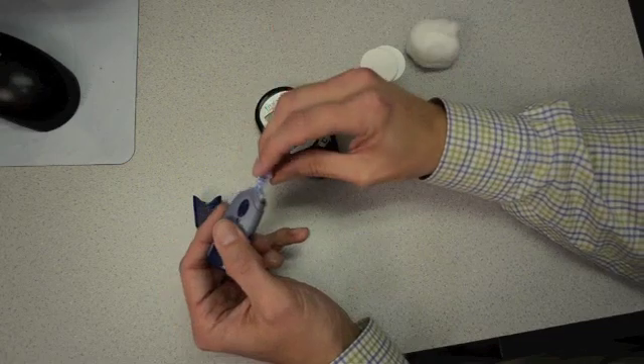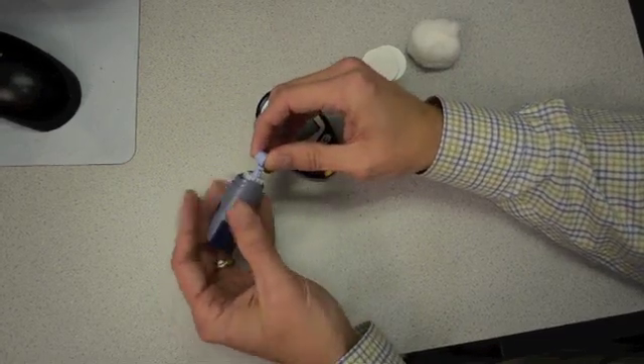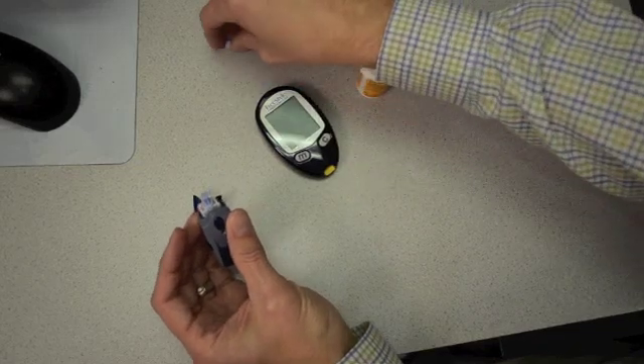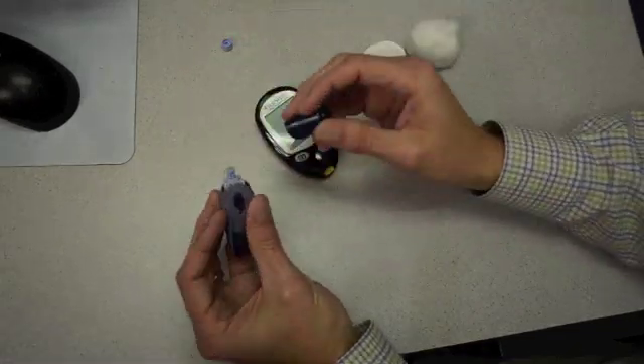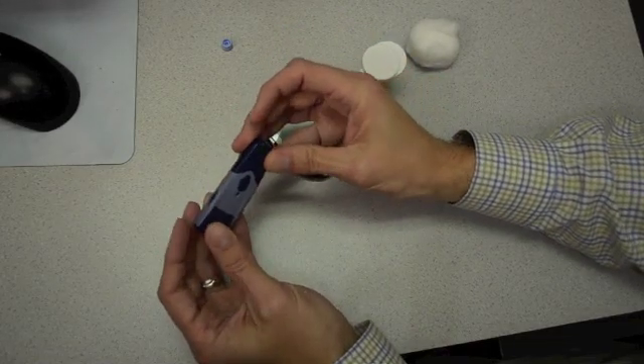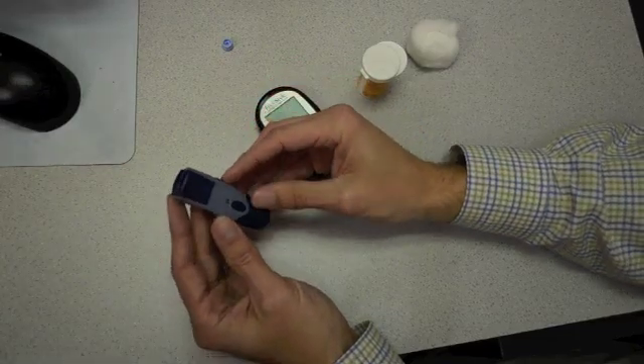We then need to expose the needle, which can be done very easily. We just twist off the safety portion and pull straight off, and the needle is exposed — very small, very sharp, virtually pain-free. After we expose the needle, we put the cap right back on top. The last thing I recommend is making sure we set the depth. I typically recommend going with the most shallow setting. Most folks can get an adequate blood sample size at even the most shallow setting, but if you have calluses or dry or rough skin, you may have to set the depth a little bit deeper to get an adequate blood sample.